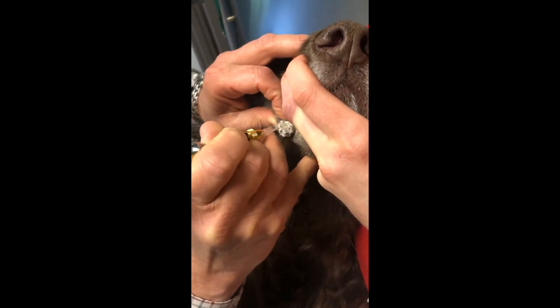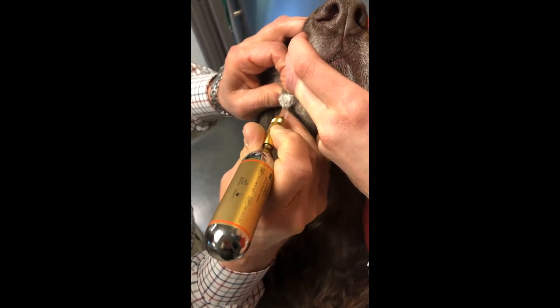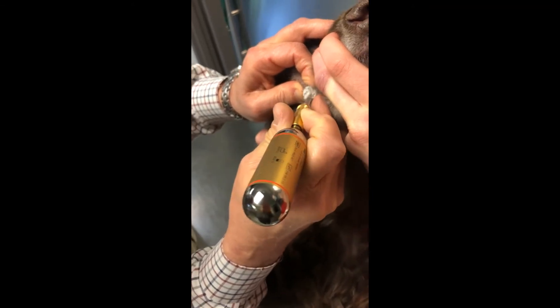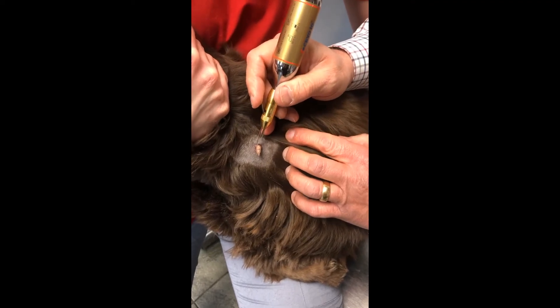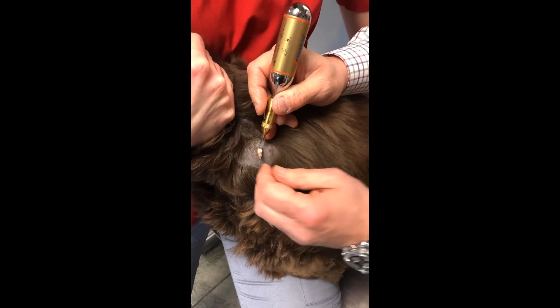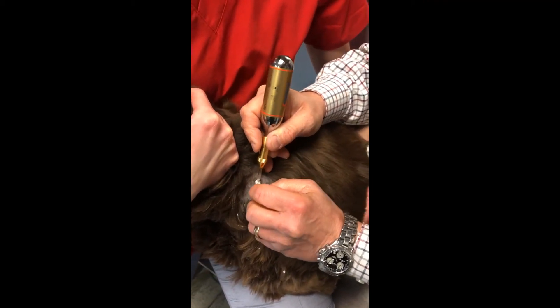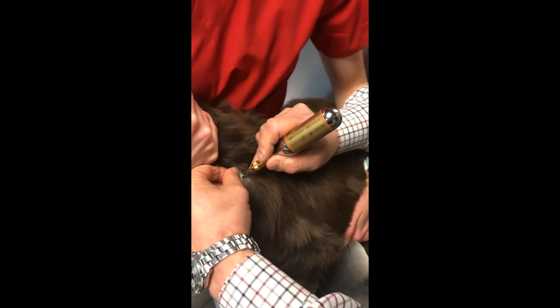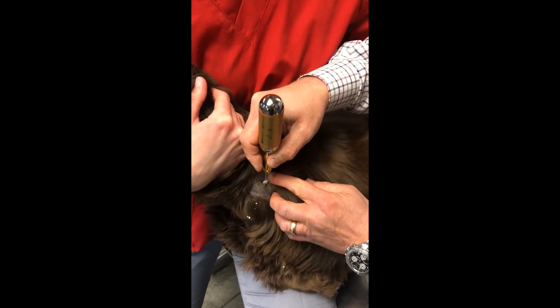Making sure that we knock off any ice crystals so we get the full thermal effect on the mass. The lidocaine is not necessary, but in an area of the face it definitely makes it less arduous to get the mass frozen. This is the mass post-thaw cycle and we're going to start again at the base, freezing as we go and knocking off any accumulation of frost.